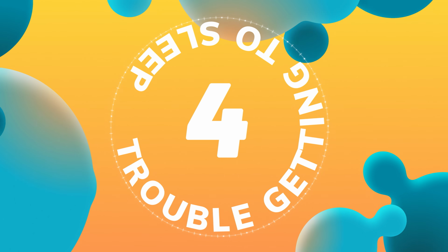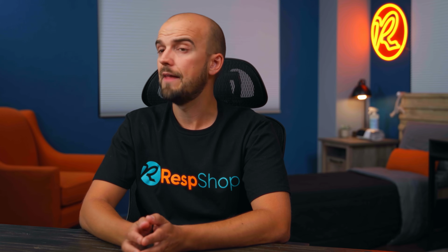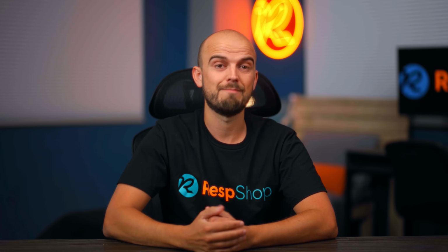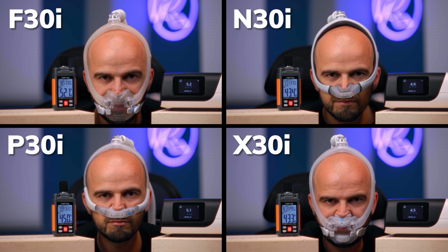Problem number 4, trouble getting to sleep. CPAP machines help to keep you asleep, but they certainly don't help you to fall asleep. And this can be difficult, especially for beginners. After all, the machines make a noise and they force air into your nose and mouth. Now, noise can be tricky because what counts as noisy is a subjective matter, and the overall level hugely depends on the machine that you're using. The official decibel readings that they come with can work as a rough guide, but that's really all they are. It's a very personal matter.